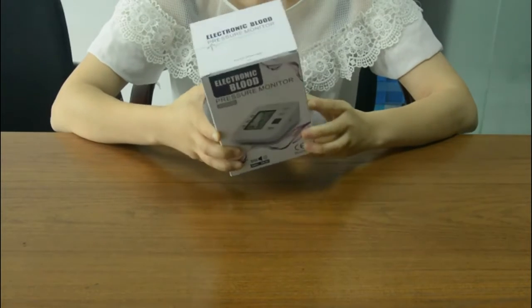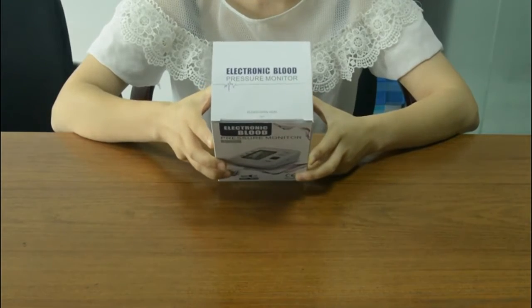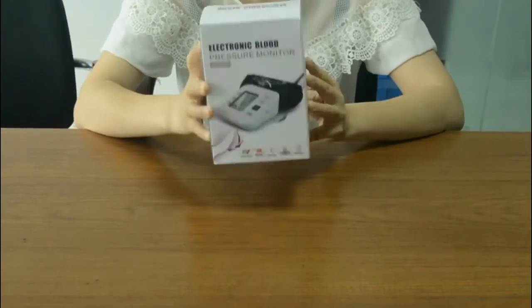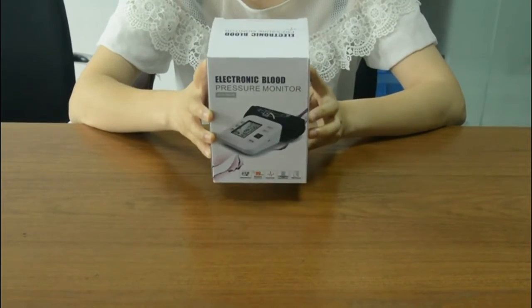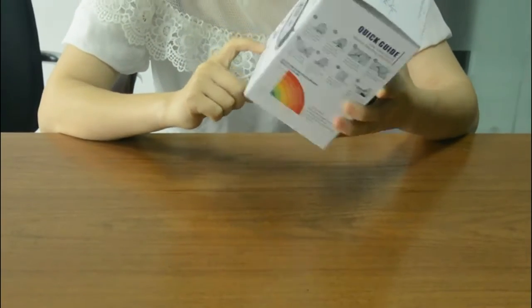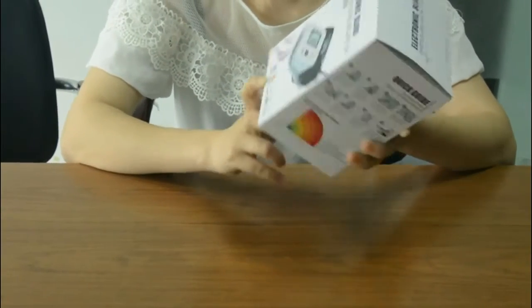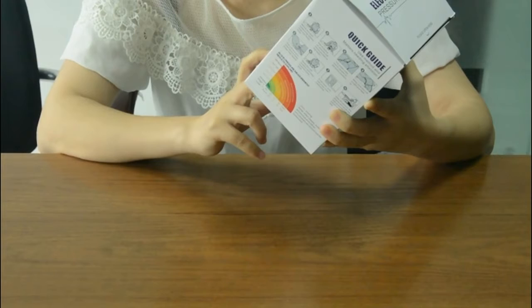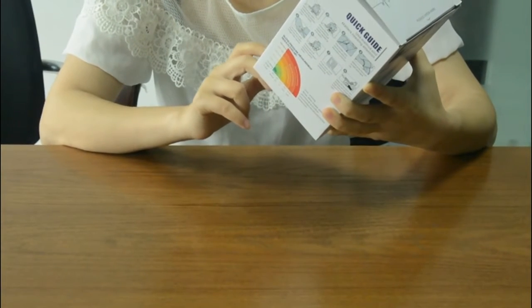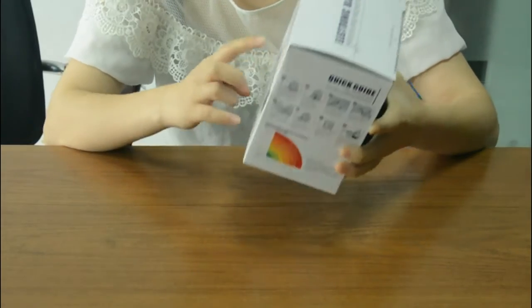Hello everyone. Today I want to introduce our electronic blood pressure monitor. You can see it has gearbox packing, a USB charger, 99 memory function, pulse and blood pressure measurements, and a big display.